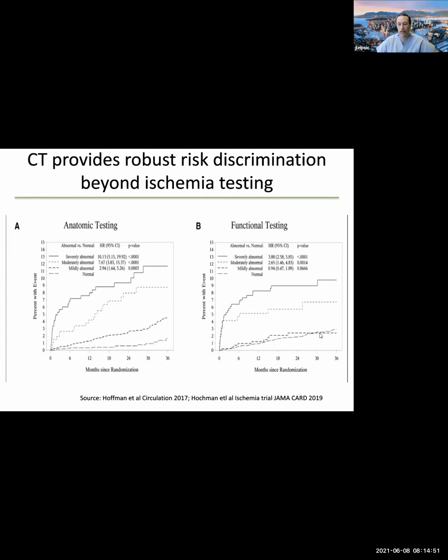On the other hand, when they looked at the SPECT data, those are the mildly abnormal SPECT, and a normal SPECT had the same downstream outcome. So I would posit to you that there's a real opportunity to really personalize medical therapy when you have undertaken CT for investigation of your patients.